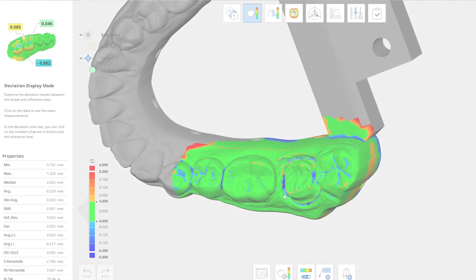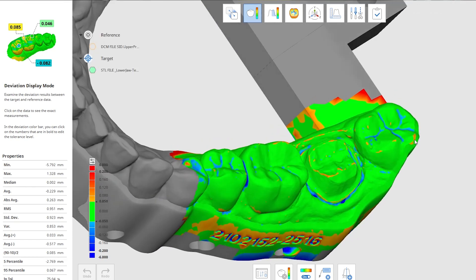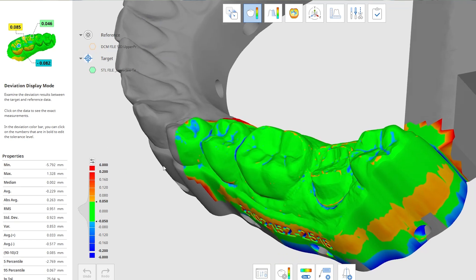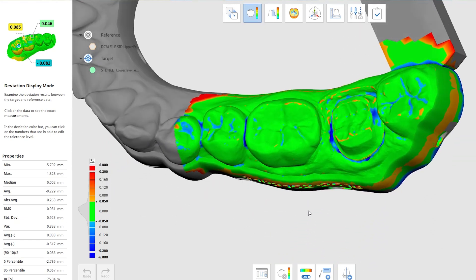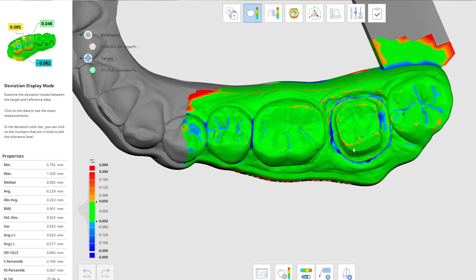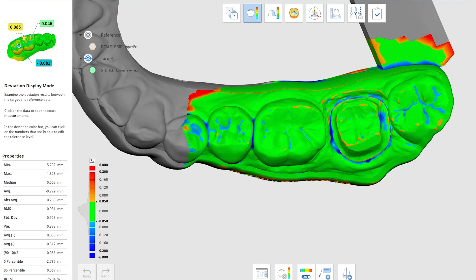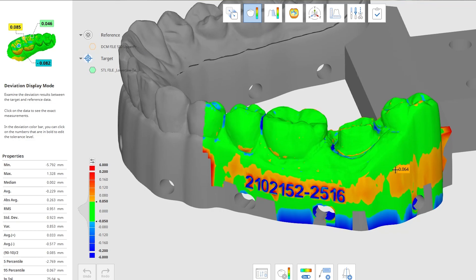He hits the Analyze function and you can see we're looking at the contacts there. The contacts are all green, showing it's within below five one-hundredths of a millimeter, which is an acceptable discrepancy for contact. We use this several times a day for checking model accuracy and also comparing old digital impressions versus new if there are any failures in a crown.